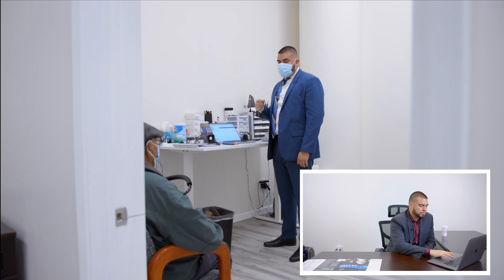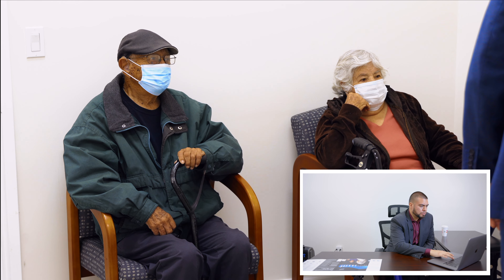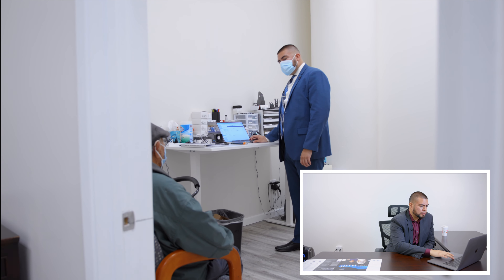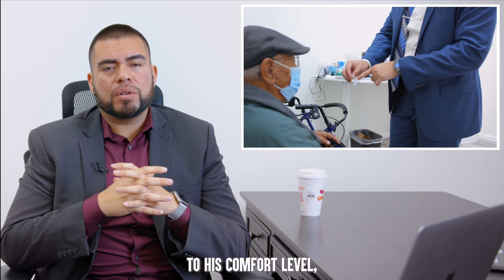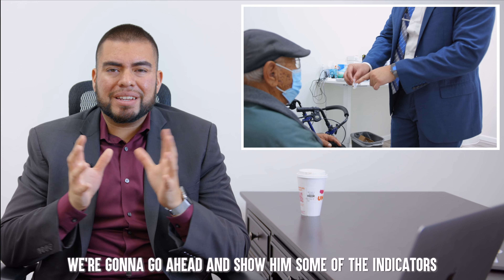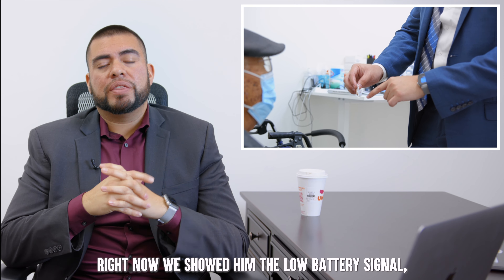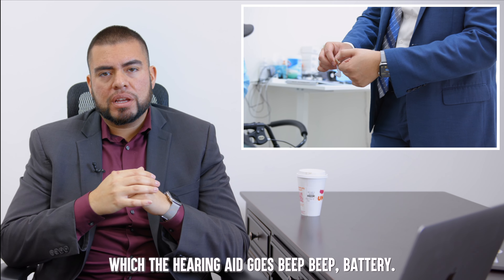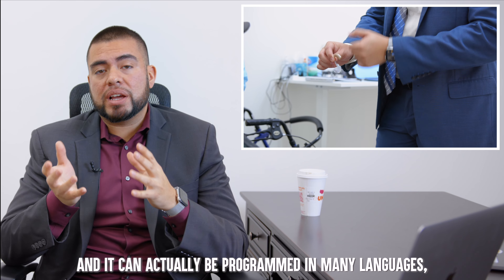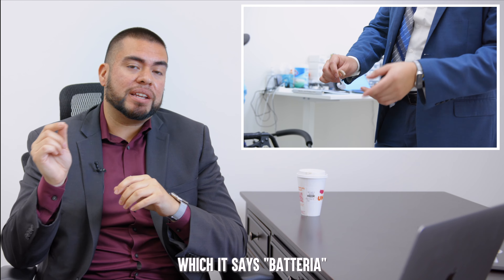These units are not going to use batteries — they are rechargeable. Now that we have the hearing instruments at his comfort level, we're going to show him some of the indicators the hearing aid provides. For example, we showed him the low battery signal, where the hearing aid says 'beep beep, battery.' It can actually be programmed in many languages — in this case it was in Spanish, so it says 'batería.'